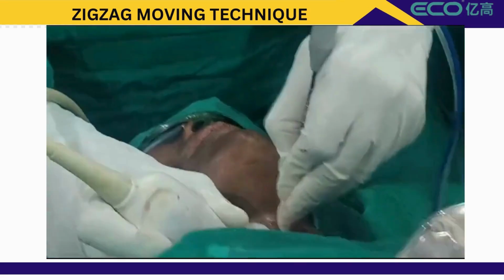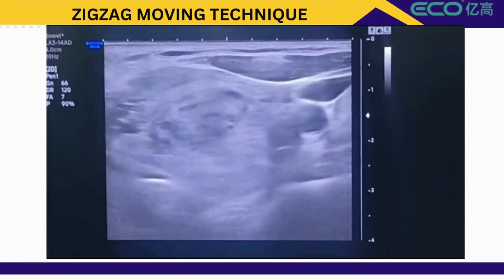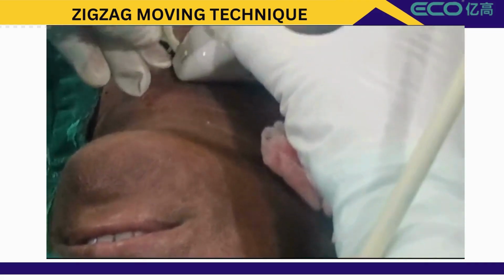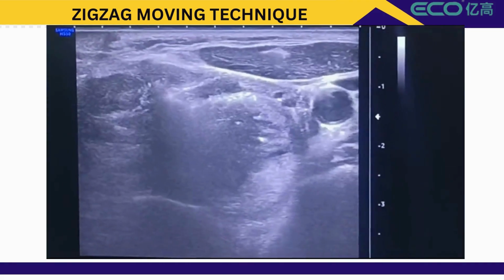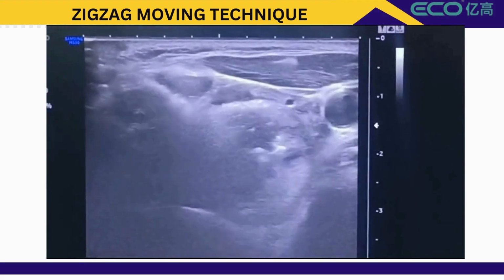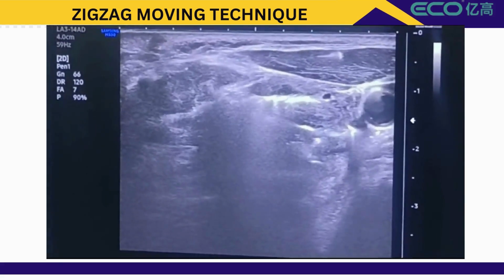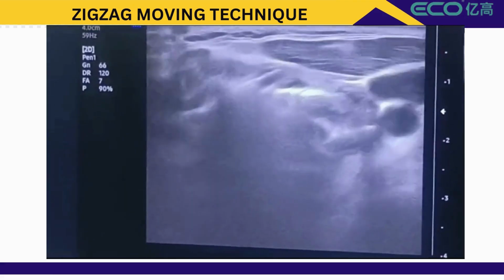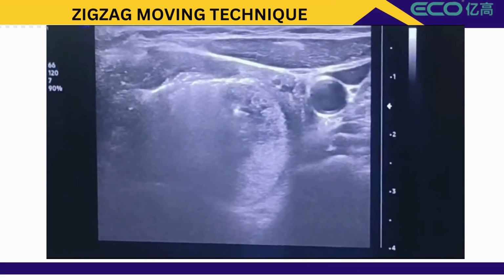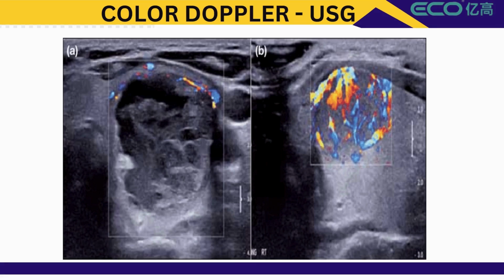Moreover, here you can see the angulation between the transducer, the ultrasound probe, and the antenna. So you can plan this completely. It is not a blind procedure, it is an under-vision procedure. Here you can see the carotid artery, the carotid sheath, and there is fluid. It is called hydrodissection. This will act as a barrier, stopping the heat from reaching the opposite lateral structures.